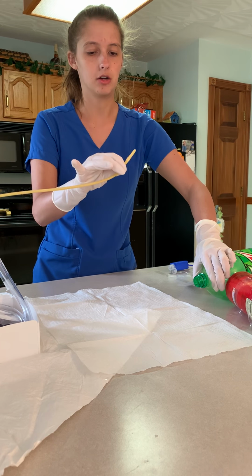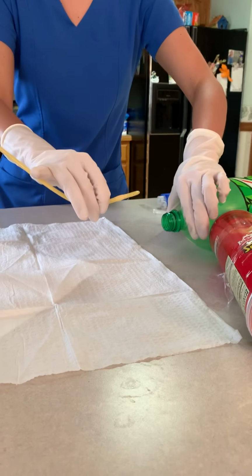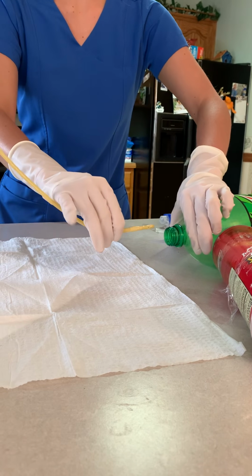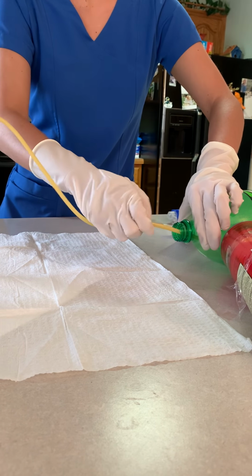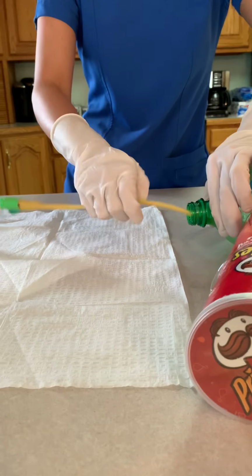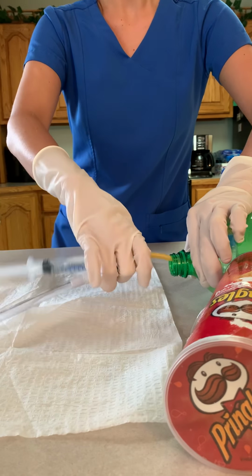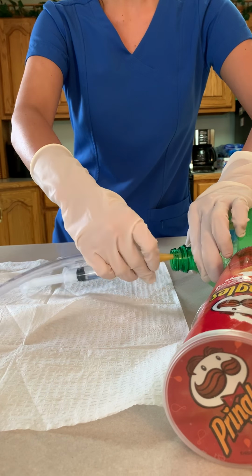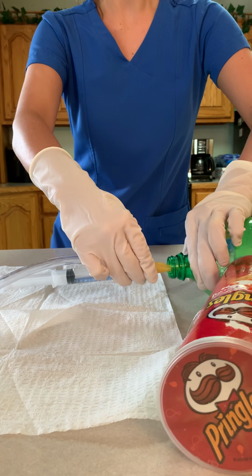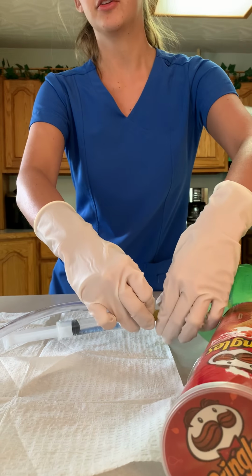And so again, I'm going to go into the urethral meatus, and I'm going to instruct the client to take a deep breath. And we're going to make sure we do not touch our sterile hand against the penis when we do this. So we're now going to go in. And again, we're not touching the penis with our sterile hand until we stabilize the catheter. And we're going to go all the way up to the Y bifurcation.